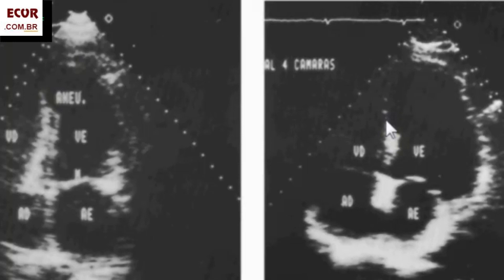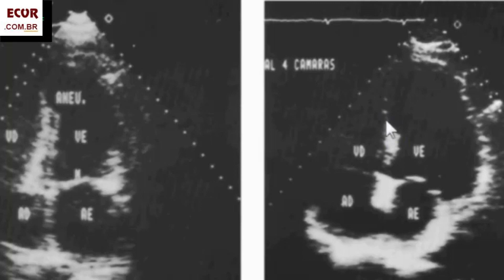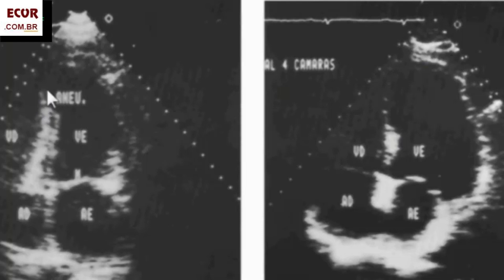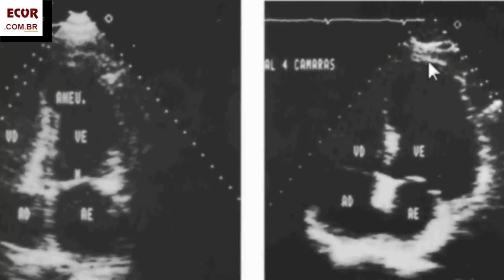That means that this area here is the neck of the aneurysm. So: dilation, fibrosis, the neck — sudden thinning of the wall. Here you can see how the wall gets thinner suddenly — this is the neck of the aneurysm. The other necessary condition is that the wall of the aneurysm must be dyskinetic. It has to move outward because it shouldn't have viable myocardium in the aneurysm.